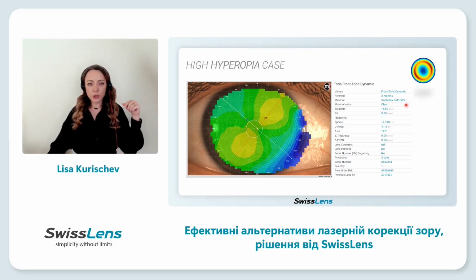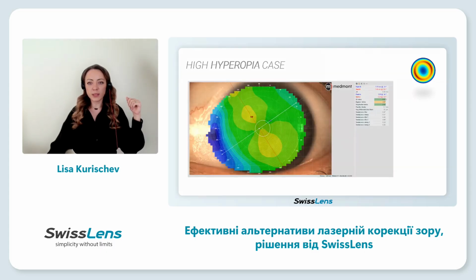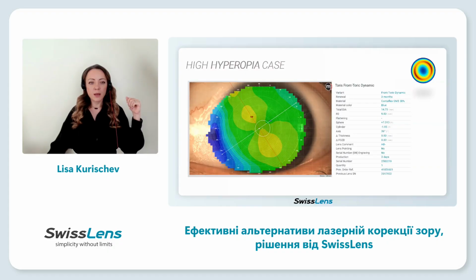This is a material which we use for dry eye, and I took clear for the right one and blue for the left one. I did the same with the left eye. Here you can see I took blue. So we have here the diameter, the basic curve and all data.